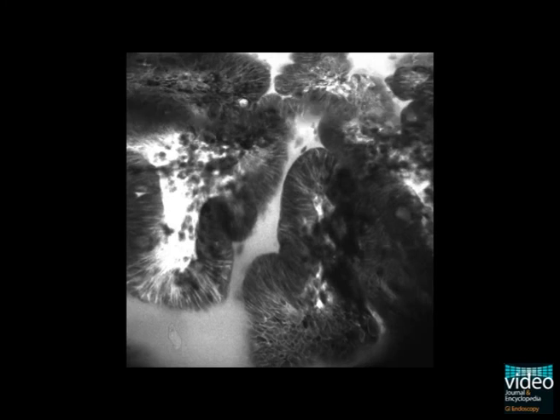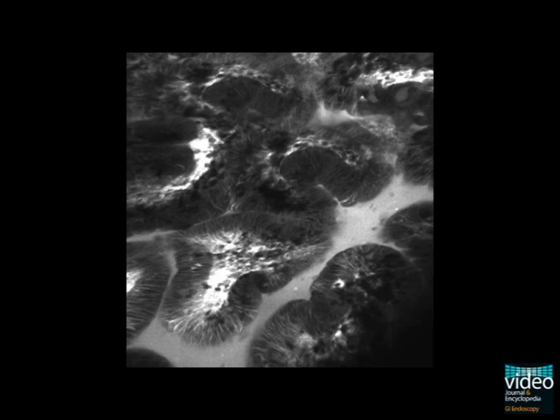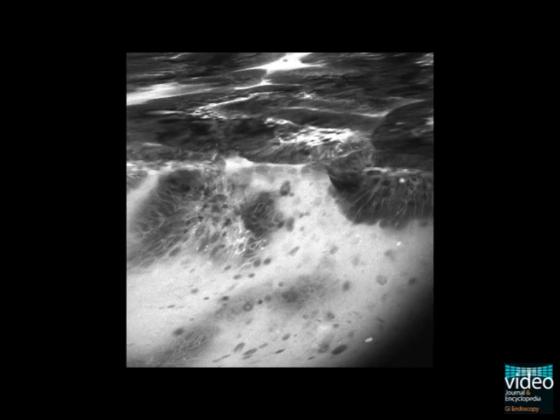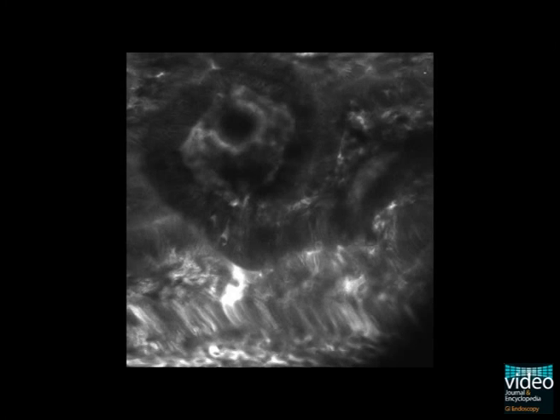The lesion is carefully screened by moving the tip across the mucosa. Other parts show destruction of the superficial layers and significant cell shedding, associated with leakage of fluorescein, indicating an ulcer.